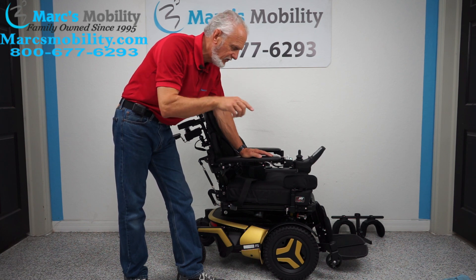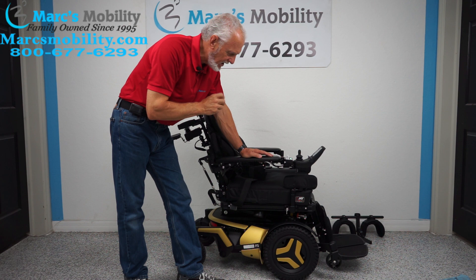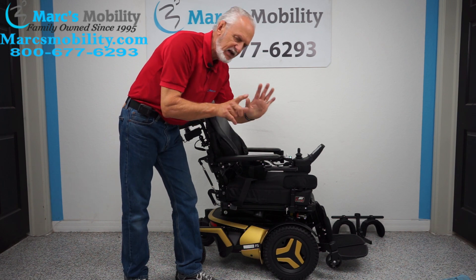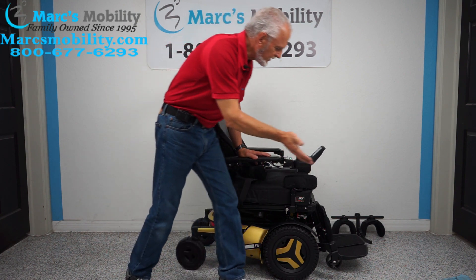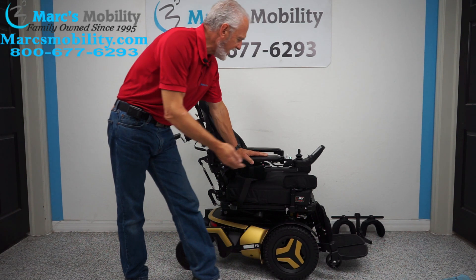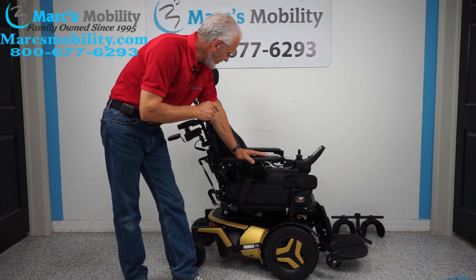This is the Permobil F5 VS — VS for vertical standing. This is one of the most engineered and probably most expensive chairs on the market. This chair has seven electrical functions: the standing feature, the electric tilt, the electric recline, the electric legs that go up and down, and the interior tilt.